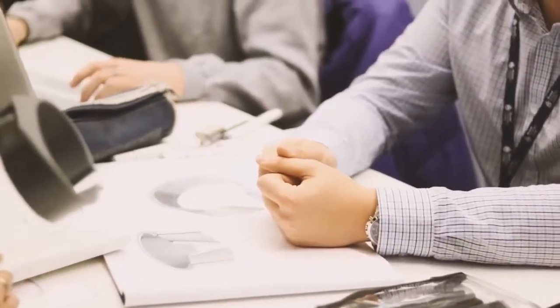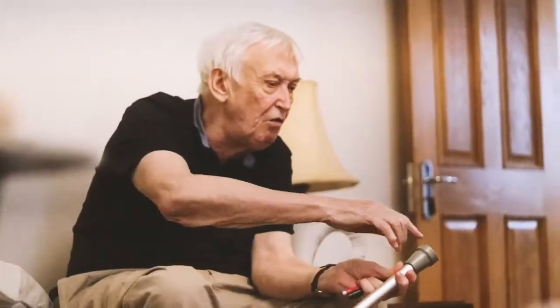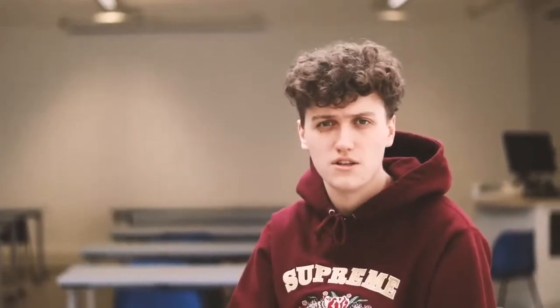After we interviewed Gerald, we sat down as a group to brainstorm different ideas. One of the many difficulties that Gerald had was uneven wear of the feet of the crutches. Another key problem that we found was Gerald's sleeves would ride up whenever he uses the crutches.